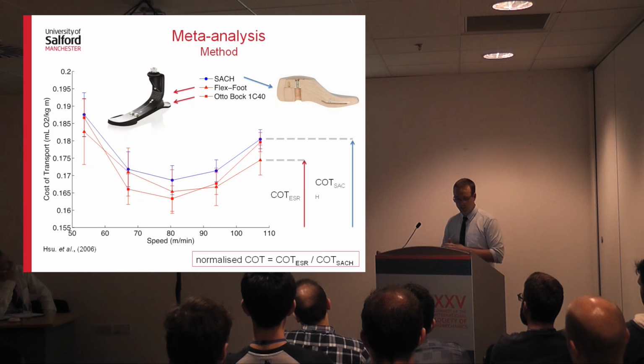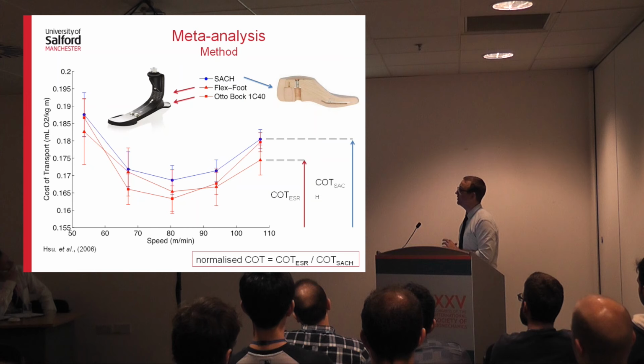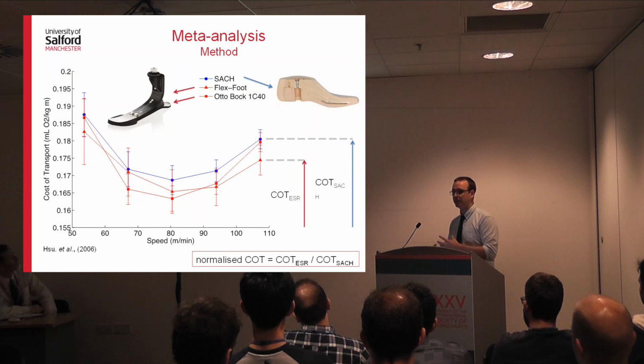So we did this for a whole bunch of studies with a whole bunch of different ESR feet. A slight caveat here is that obviously I'm lumping together all the ESR feet into one group, whereas there are quite significant differences in some other designs and some of what they're intended to do. But just for this comparison, I thought that was fair.